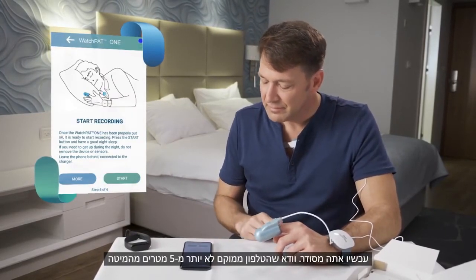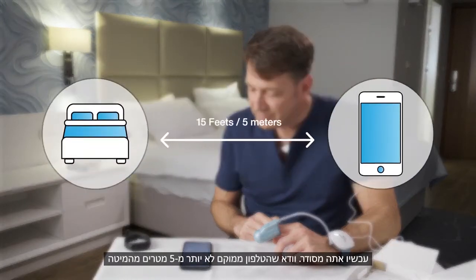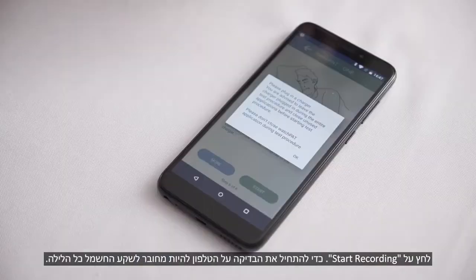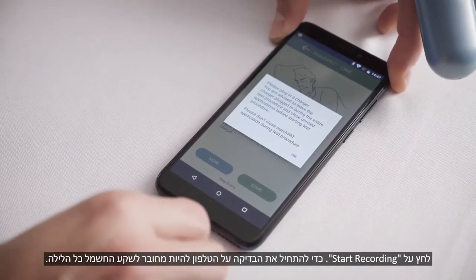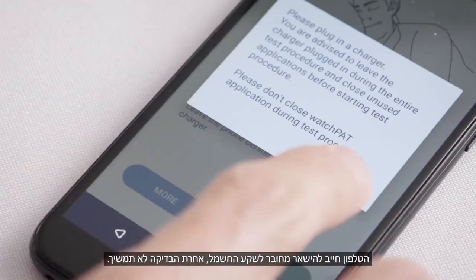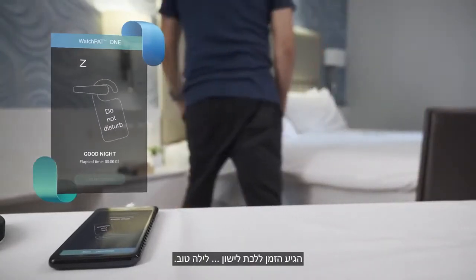Now you are all set. Make sure the phone is placed no more than 15 feet (5 meters) from the bed. Press Start Recording to start the test, and keep the phone plugged into the electricity socket all night. The phone must remain plugged in, otherwise the test will not proceed. It is now time to go to sleep. Good night.